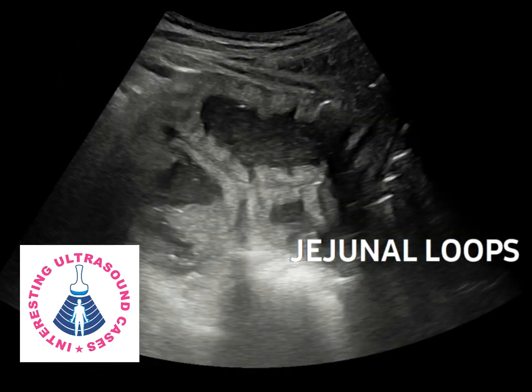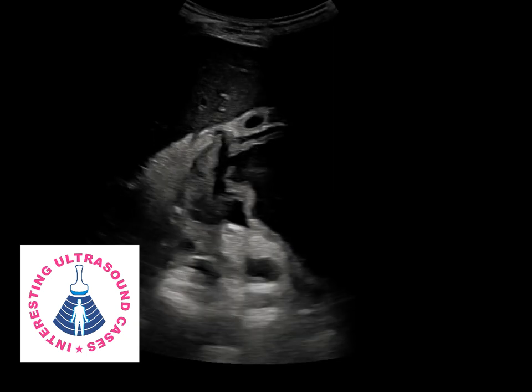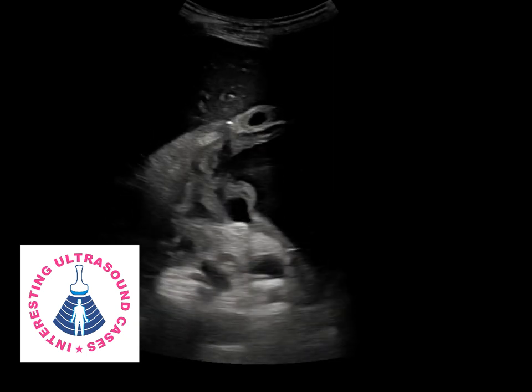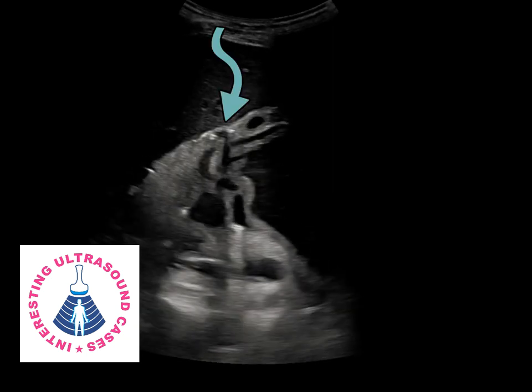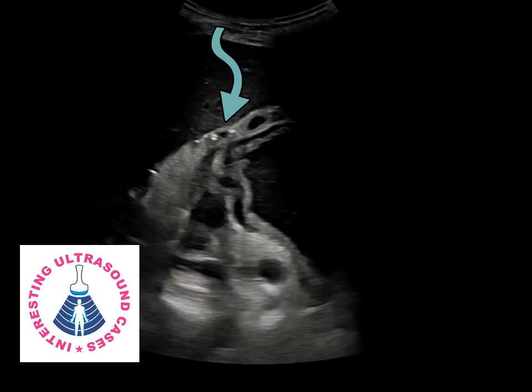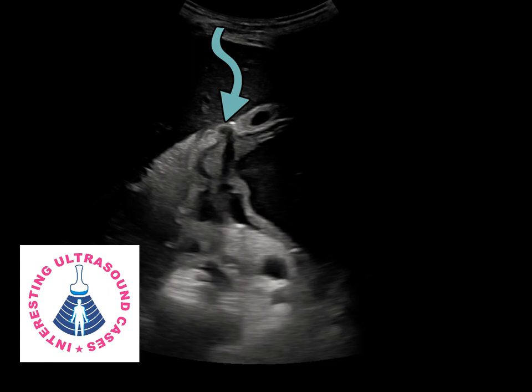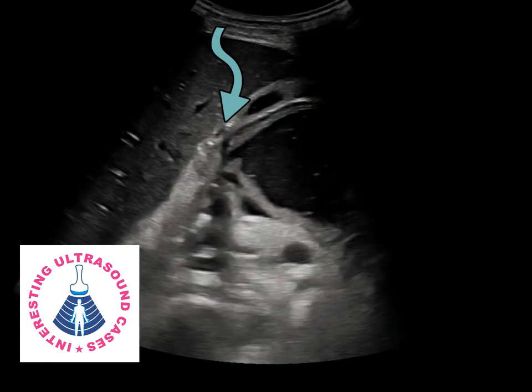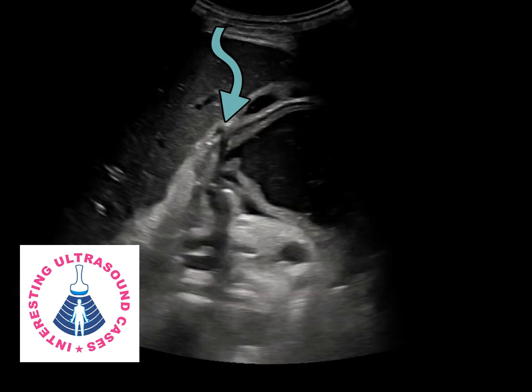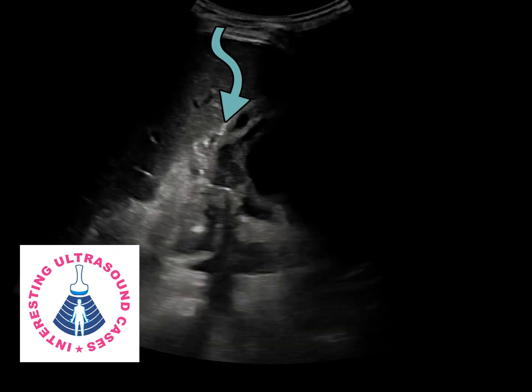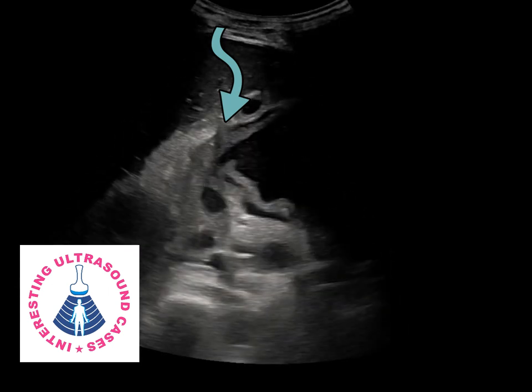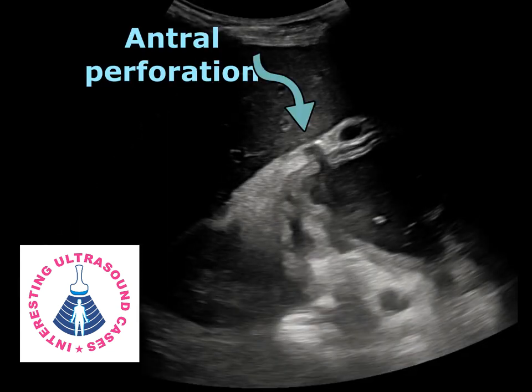The small bowel loops appear diffusely edematous, suggesting diffuse enteritis. Then I searched for the site of perforation. Here we can see a small defect in the antrum, which is the perforation site and the cause for perforation peritonitis.